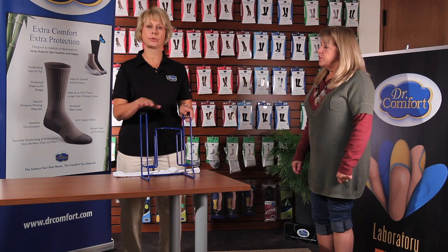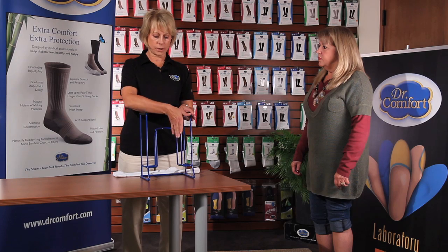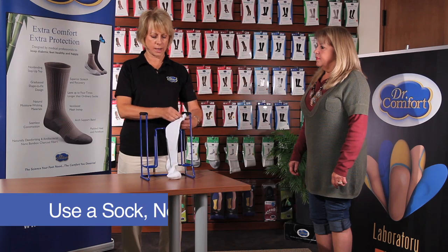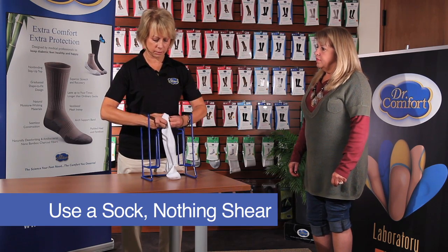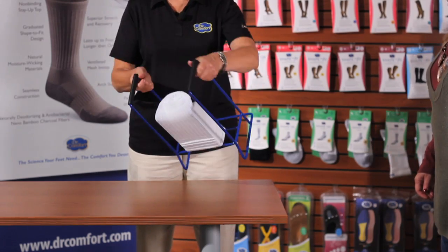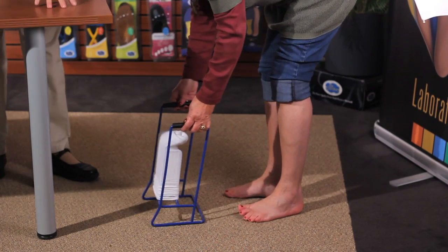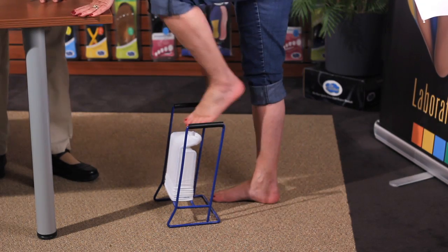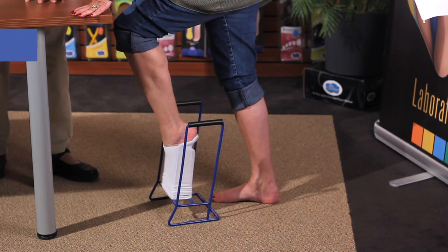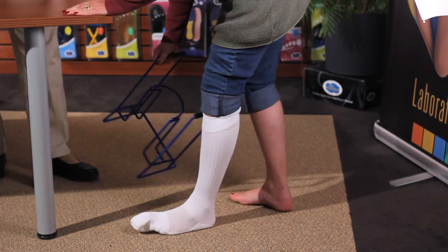Another way to don a stocking is using the metal stocking doner that Dr. Comfort Shape-to-Fit makes. It is a little bit more sturdy. You want to keep the cloth part toward the body and use a sock — it is a lot easier to don using a sock versus something sheer. You push the sock down until you make a nice heel pocket. Then if someone can't sit or bend due to hip or knee problems, you set that there for the patient. Make sure they have a table or something sturdy to balance on. Point the toe, step down into it, and pull up with the handles. Sometimes it needs readjustment.